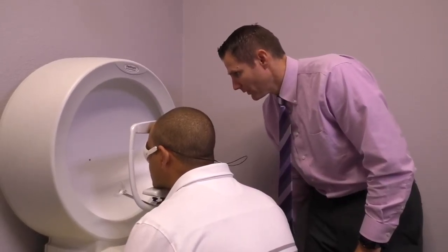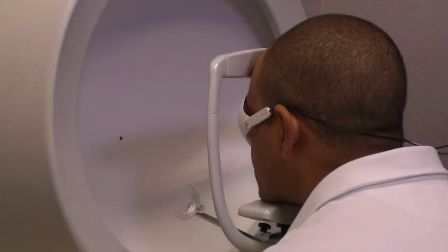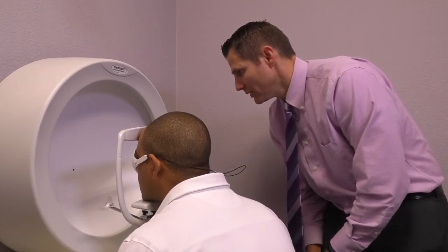You're going to click that little button with your thumb. While you're looking straight ahead, you want to see a little light to focus on. And then if you see any flicker of light all the way around throughout the bowl, you're going to click that button. If you don't see something, don't worry about it — just keep looking straight ahead. Blink as much as you need to. We'll go ahead and start the test now.